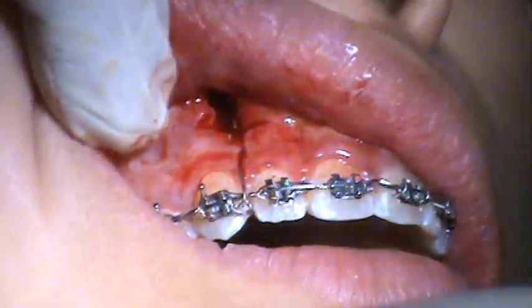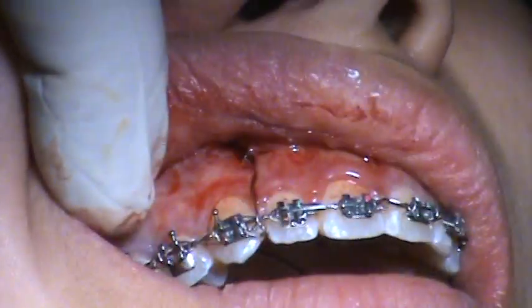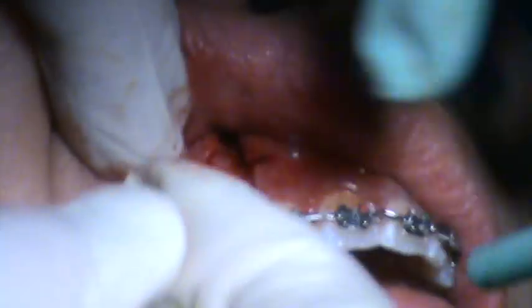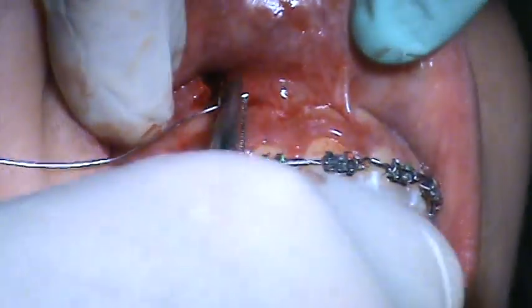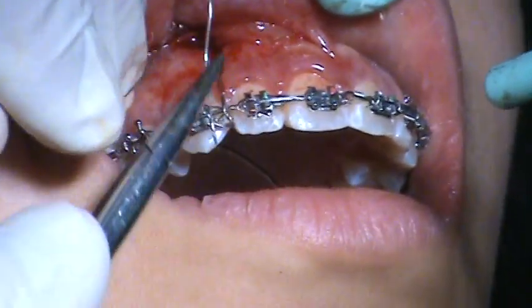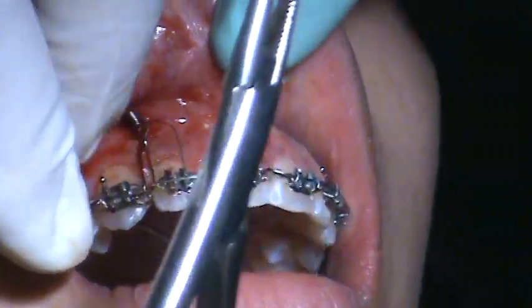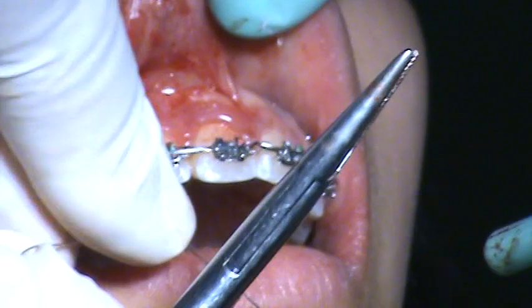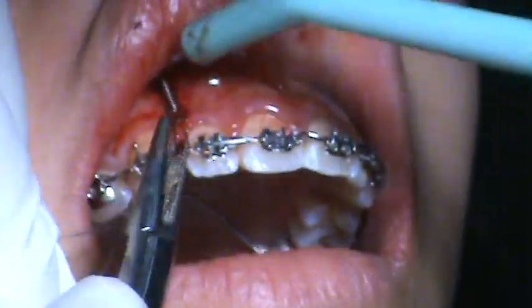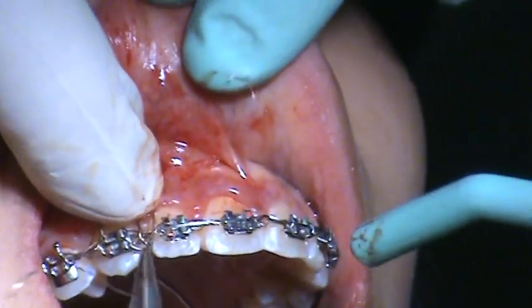That means our 6 millimeter coil is going to be activated up to 10 millimeters as they go up. That's plenty of range to do 6 millimeters of intrusion. So we have about 4 or 5 millimeters of activations. On the 6 millimeter coil, 2 millimeters of activation is 150 grams, 3 is 200 grams. So we'll be intruding about 5 to 6 millimeters in this case.